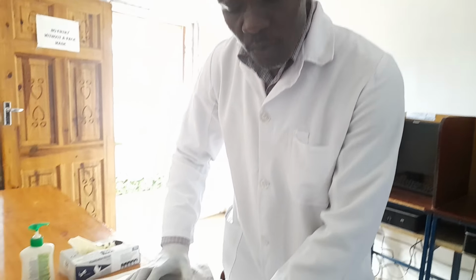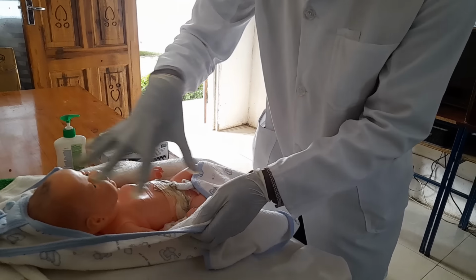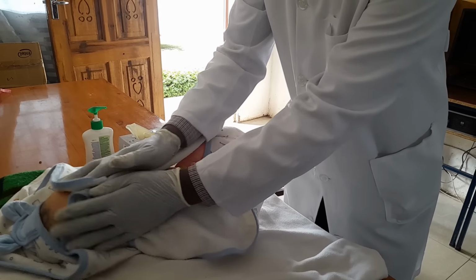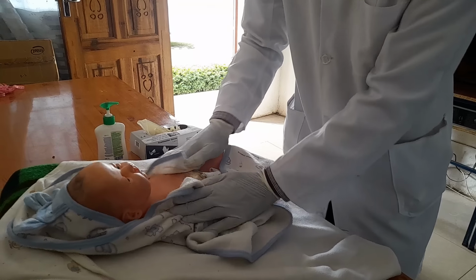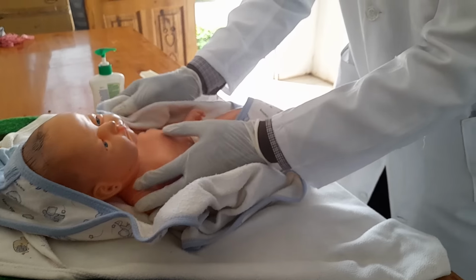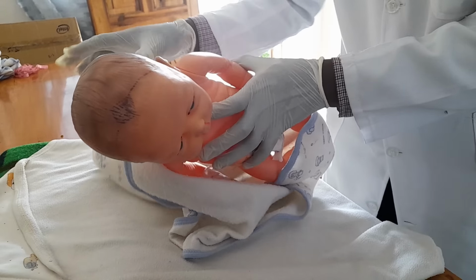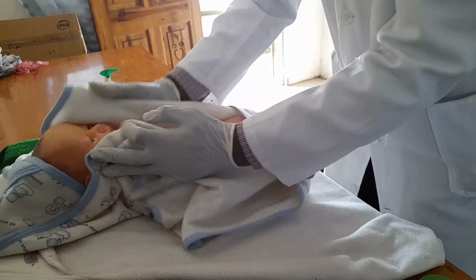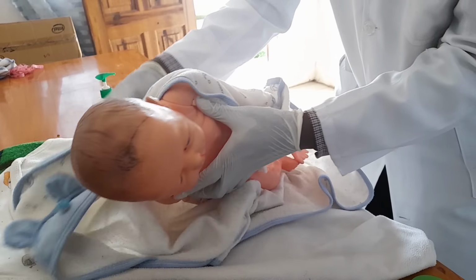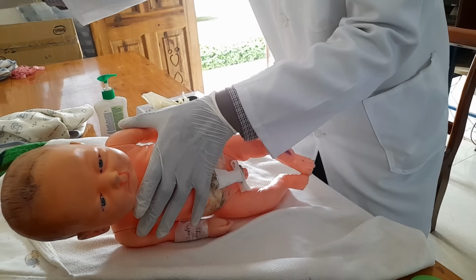Okay, so after you do that, then you're going to wipe the baby, because this baby has got amniotic fluid on its body. So what you're going to do is you're going to wipe. Once you do the wiping, then you can remove this wet receiver. This receiver is wet because you have used it for wiping. As you can see, you're wiping like that. So this receiver or baby blanket, it's wet. So I'm going to remove it like that and discard it or put it aside.